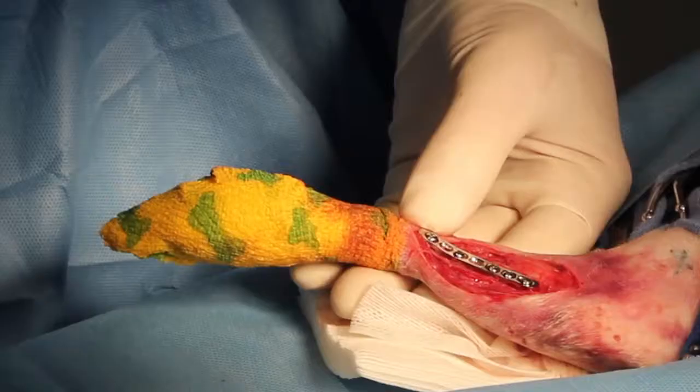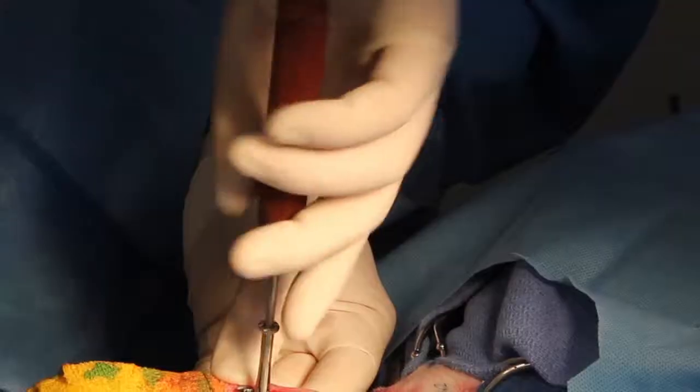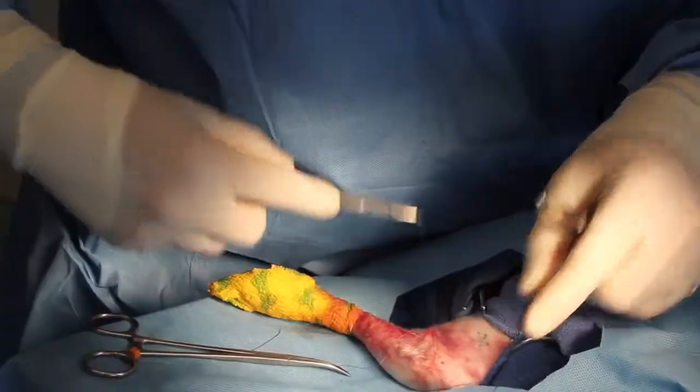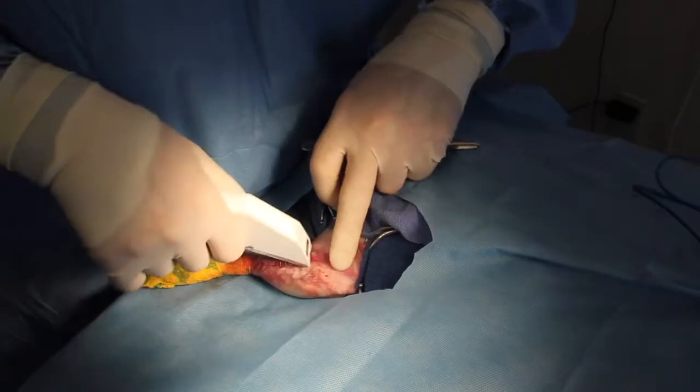This process is repeated until all the screw holes are full. However, holes directly over the fracture site are left open. Then, all the screws are checked for tightness, the bone is checked for stability, and the surgical wound is closed in a routine manner.